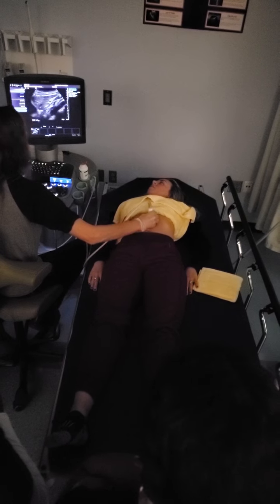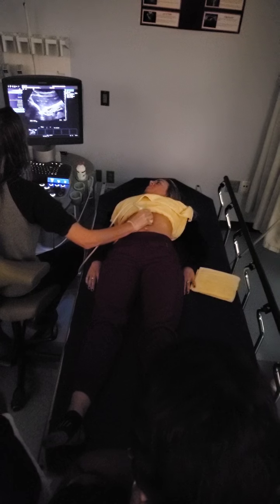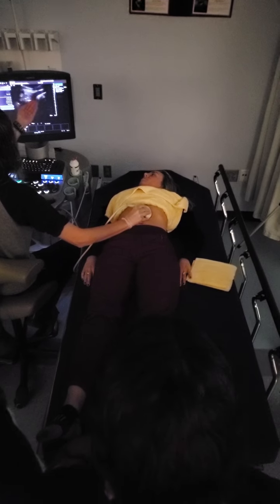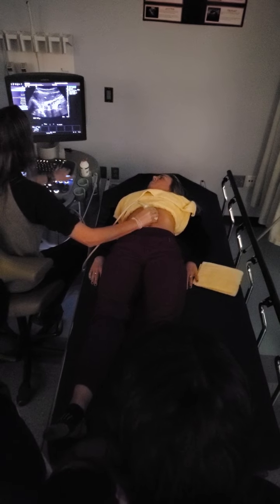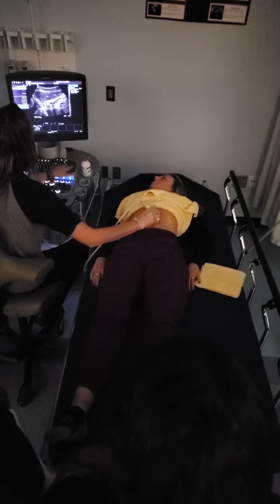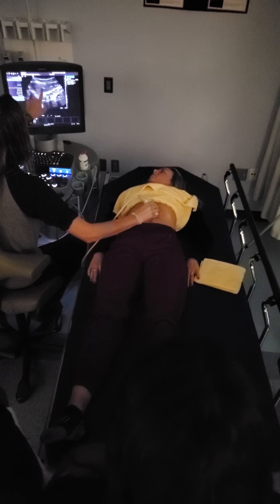Go ahead, big breath in and hold it. And then we're going to get all the way out in this lateral. And eventually this is just going to disappear. Do I want this as an image? No. Show me some meat and potatoes. So you're going to have to come back a little bit. It's just over here. And this gets kind of boomerang looking or kind of triangular.